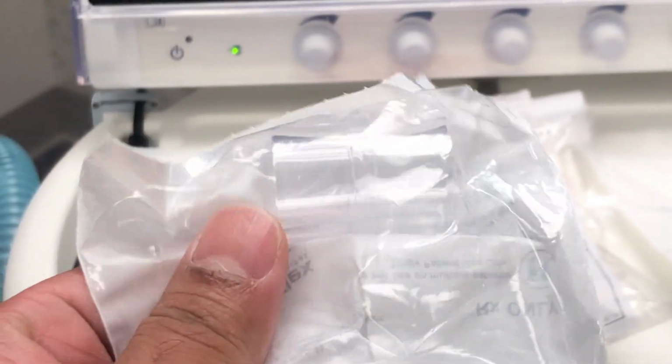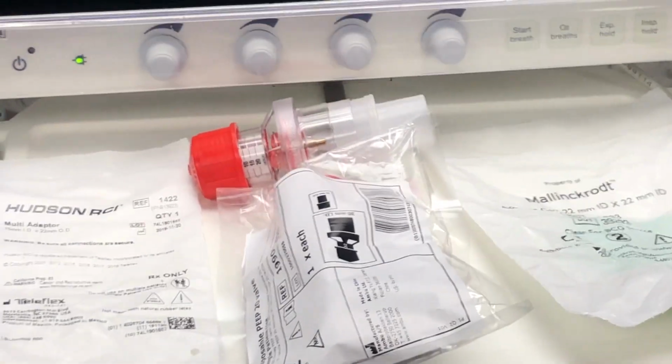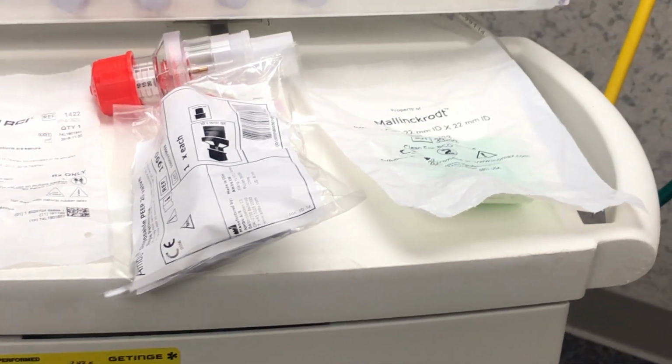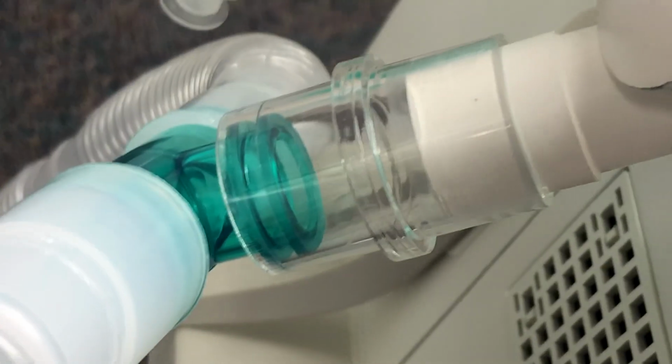And this is the adapter. This is the 15 into 22, and then we have the 22 millimeter adapter, which comes in 2 forms. One is the plastic one which I have used, and you can see it right here.